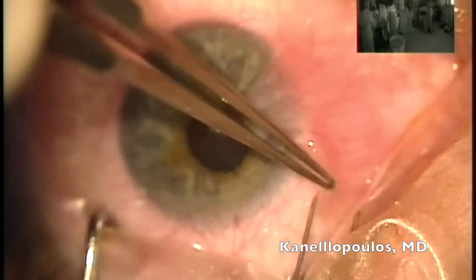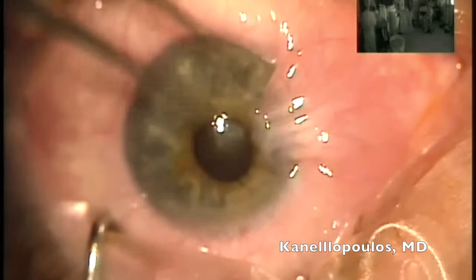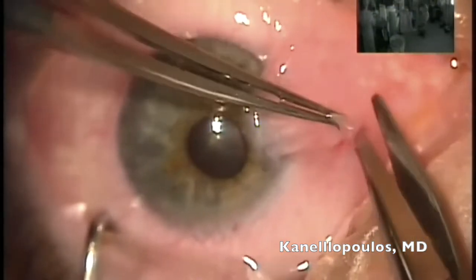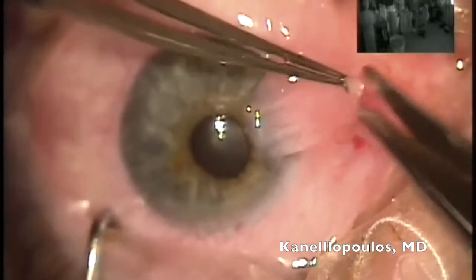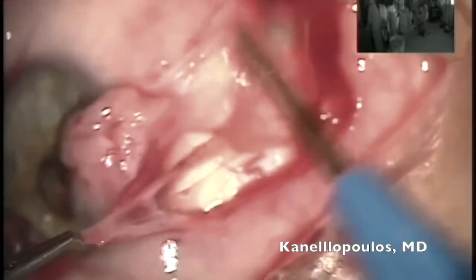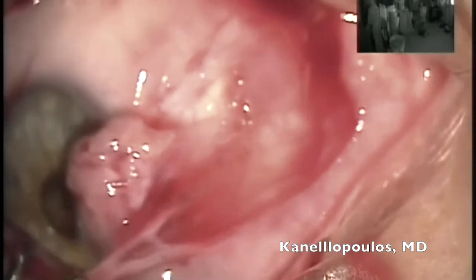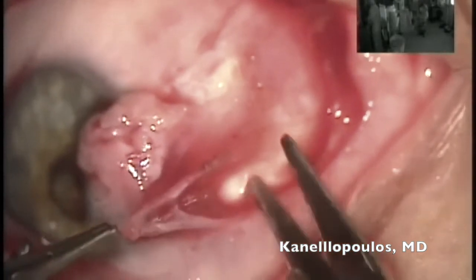Our technique starts with peribulbar anesthesia — I'm injecting here normal saline; it would be 1% xylocaine if this was done under topical. I'm going with my blunt Westcott scissors — that's very important here — the ones I use for trabeculectomies as well. Very meticulous cautery, being very careful not to injure the medial rectus.